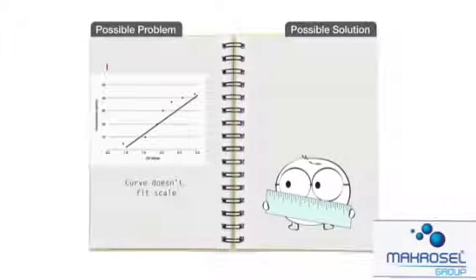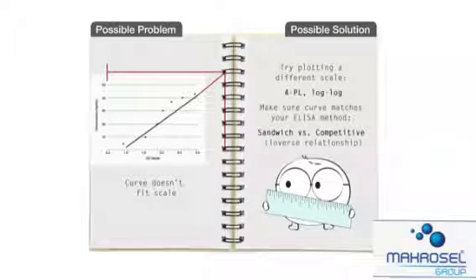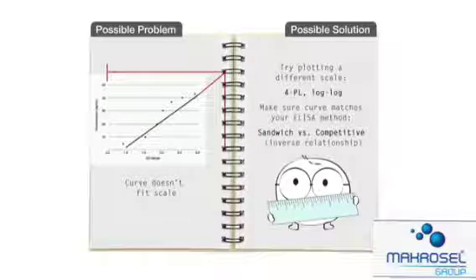In some cases, the curve you are using may not fit to scale. Therefore, you may want to try plotting a different scale that matches your method such as a four-parameter logistic curve.